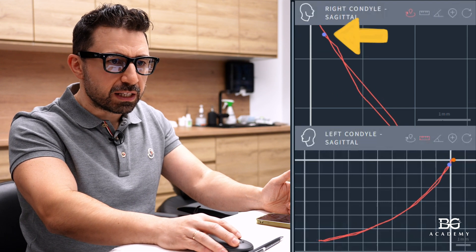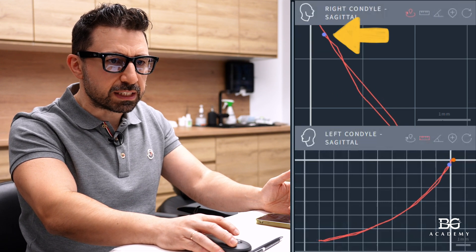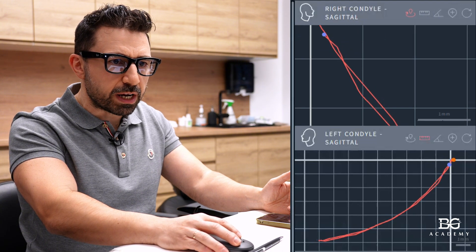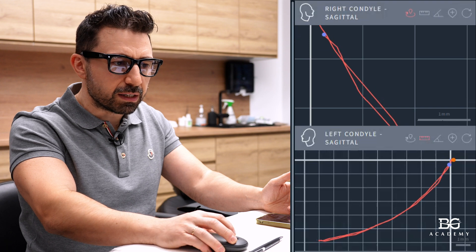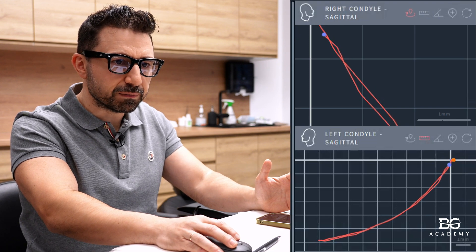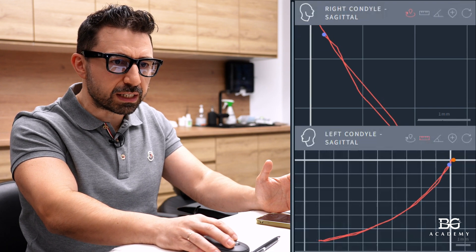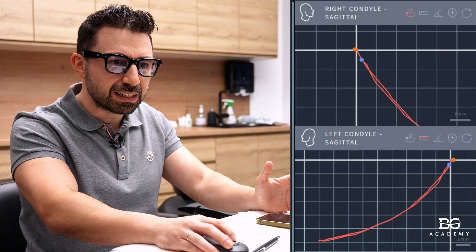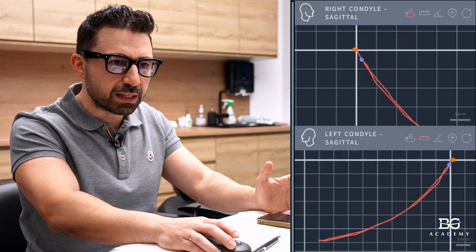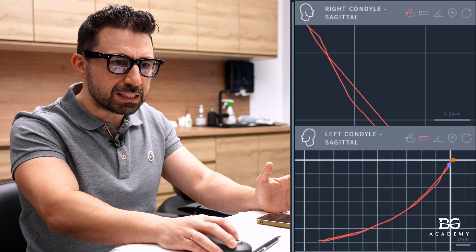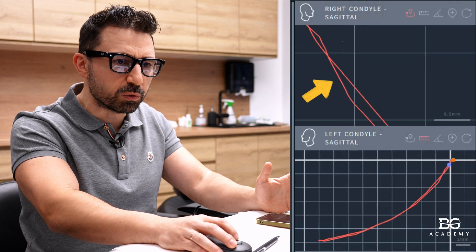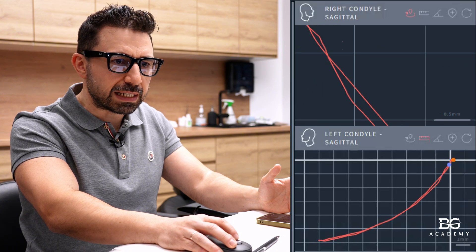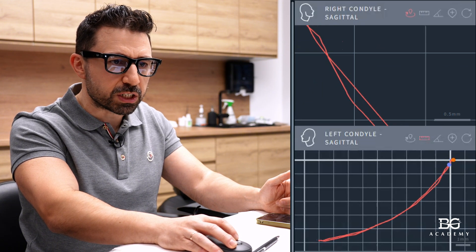How we interpret this tracing: when she goes forward, in this area she jumps onto the disc. Then for the rest of the trace she moves with the disc. When she goes back, in this zone just before this cross, she jumps off the disc. So when you do palpation, you can feel the click during palpation here.